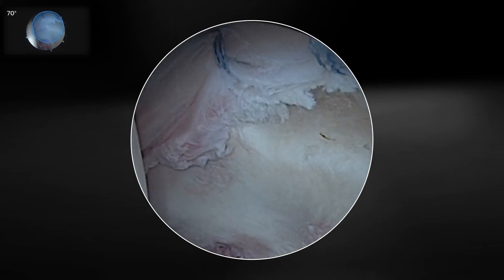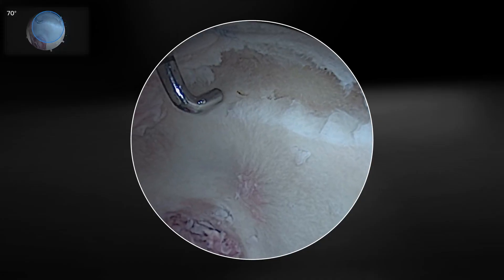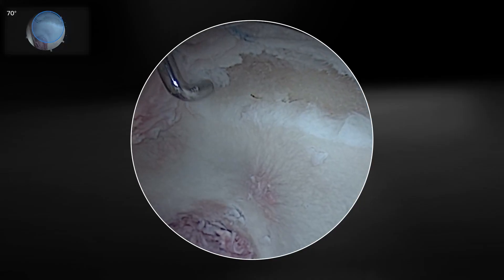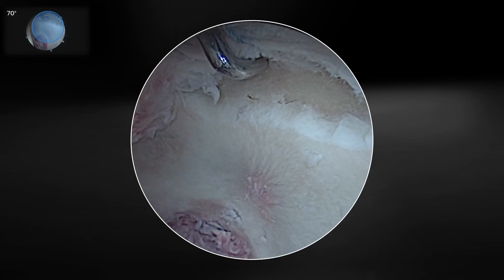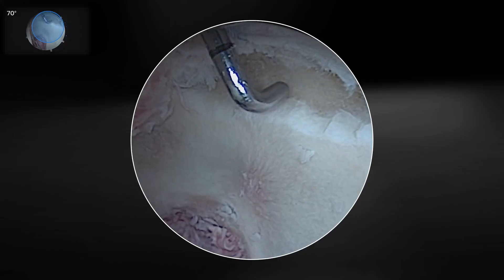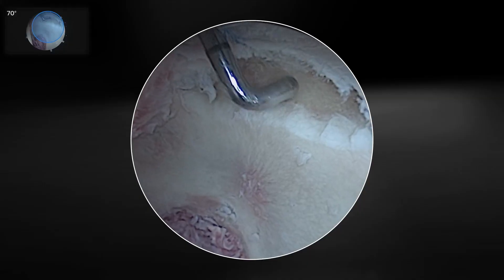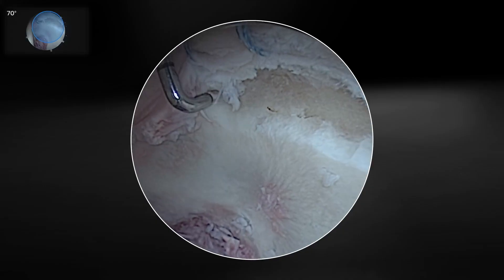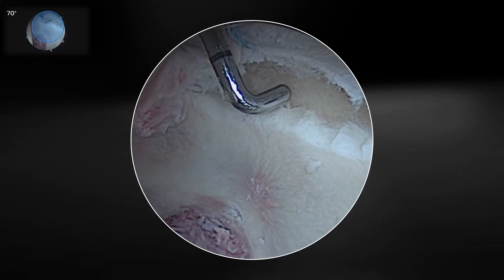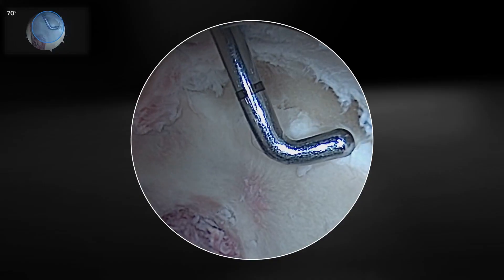What's typical and challenging with the procedure is this lesion here. We see this not infrequently in the setting of FAI, which is this area of significant grade four cam delamination. In its earliest form, we sometimes see that as a wave sign where there's debonding but it's not an unstable flap. That then progresses to become an unstable flap and then oftentimes can become fully exposed bone. For the sake of this demonstration, we have a full patch of exposed bone. Management of this has always been problematic. It's not easy to microfracture — both because of the angle, but even biologically, we have one margin that's well shouldered but the entire chondrolabral junction is not well marginated.